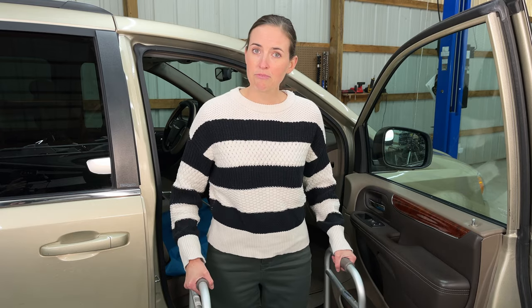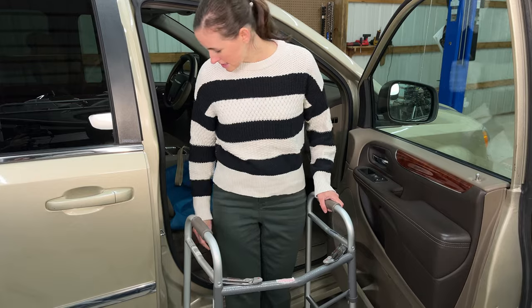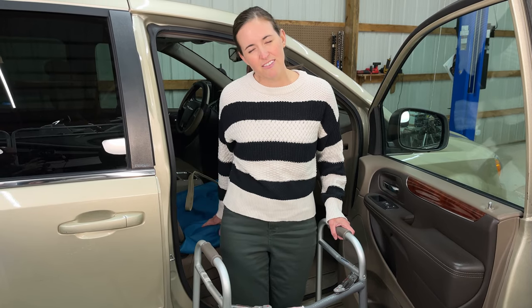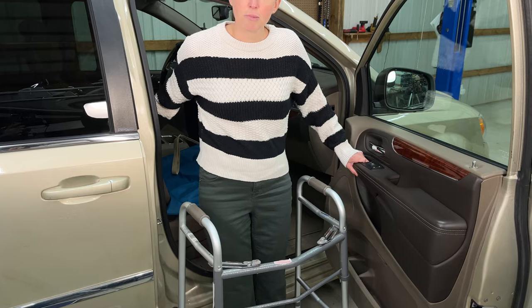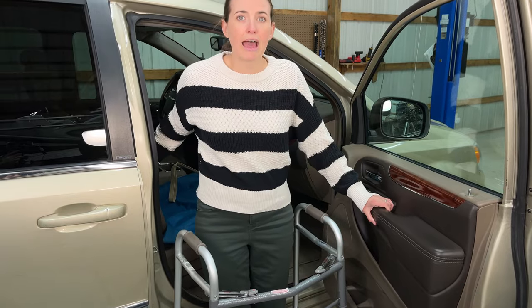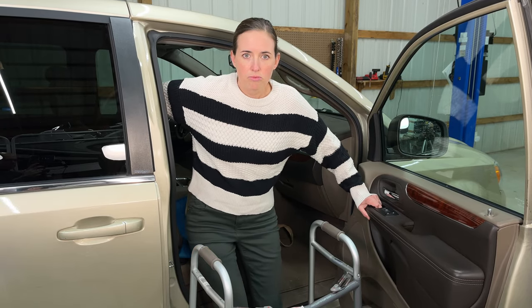I have my walker here, as you would likely have immediately following surgery. We'll pretend we're going home. You're going to back up to the car and feel the car on the back of your legs, then reach back for the seat. I like to reach high on the seat — more towards the back than onto the actual seat itself — because the draw sheet is a little slippery. You can reach back for either the seat or part of the door, depending on how much shoulder stability you have. Grabbing the door feels pretty stable.